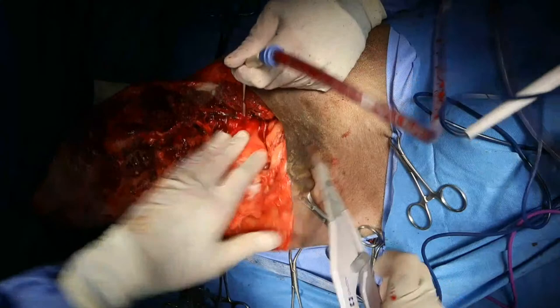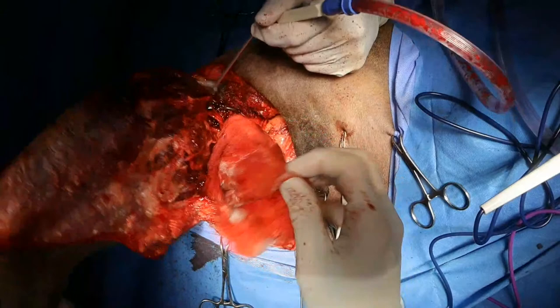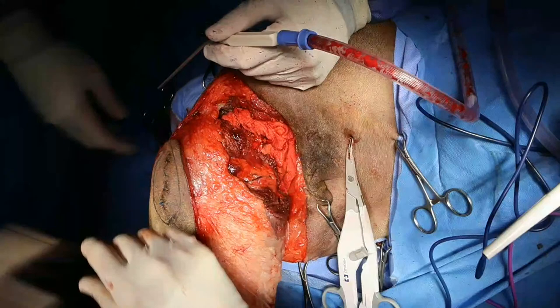All right, so things looking really good here. Bring this back up. Just put my single lap sponge. Here's my other one. Certainly not going to go on to three.